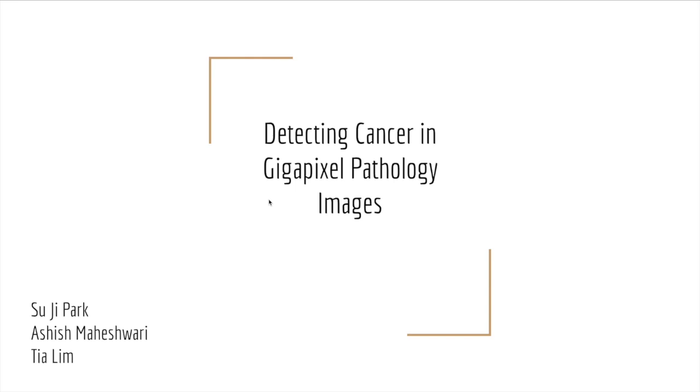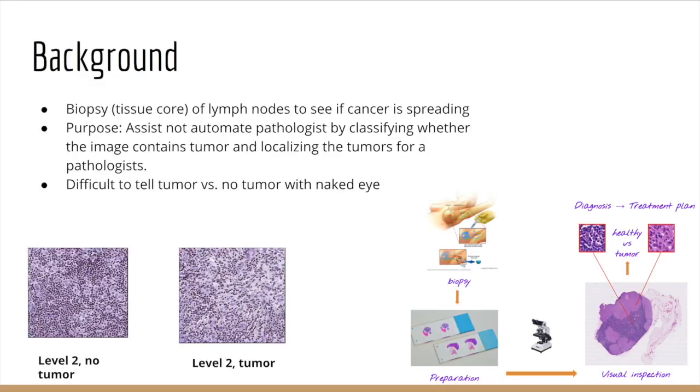We will be presenting our final class project for detecting cancer in gigapixel pathology images. We will first get started on our presentation with the background information.